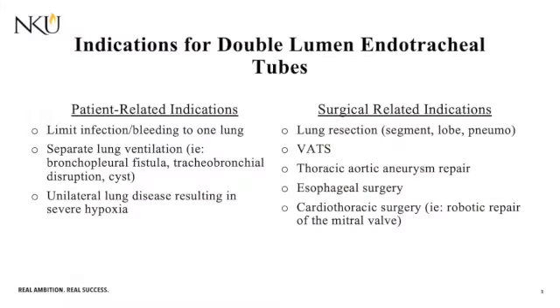Today we're going to be reviewing double lumen endotracheal tubes, including indications, contraindications, risks, and a demonstration of placement. Let's get started. Let's begin with reviewing why we would need to place a double lumen endotracheal tube.